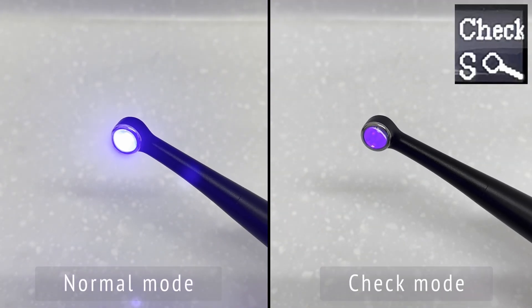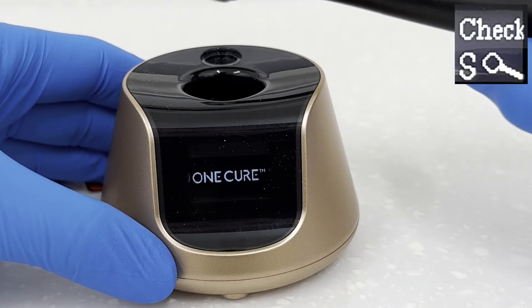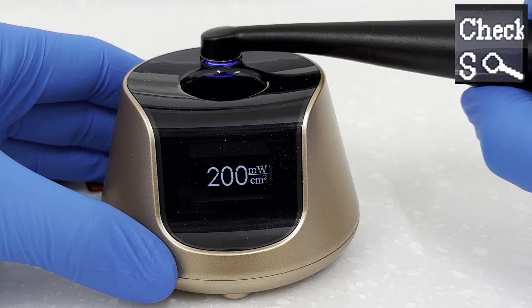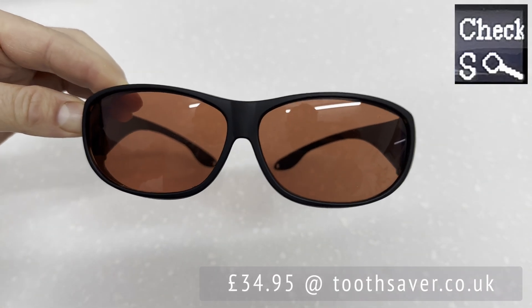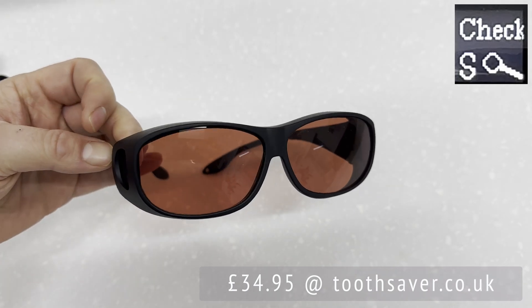The third and final mode is my favourite, one I have used many times since receiving the unit: Check mode. Check mode is officially used to show areas of decay in a cavity. The light intensity is visibly much less in this mode. It is advised to wear special glasses when using Check mode; these can be bought from toothsaver.co.uk for £34.95. Without the glasses you can still see decay show up, but with the glasses the decay is visually much clearer.